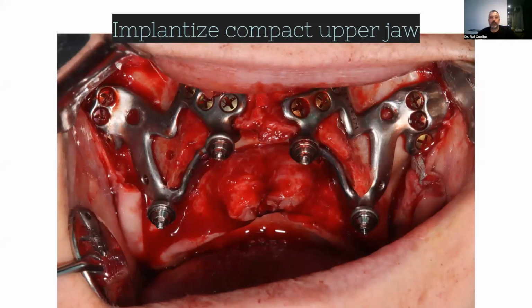And you probably will say this thing is bulky, okay? Of course it is bulky. What we need is to achieve a great mechanical performance. I don't care if it is bulky. What I want is not to have micro movements. Only by not having micro movements, and we know that, different from the past, the osseointegrated system makes the implant a part of the bone.